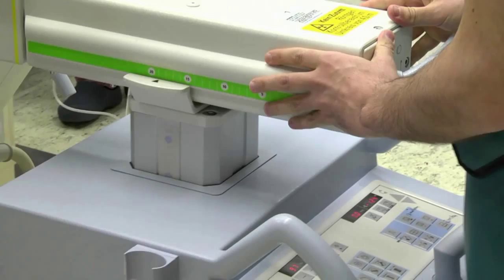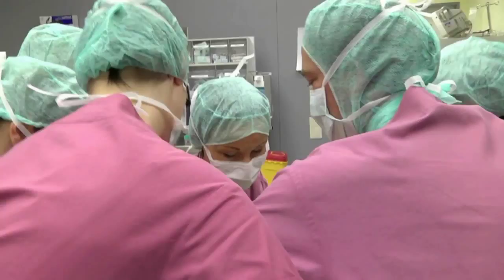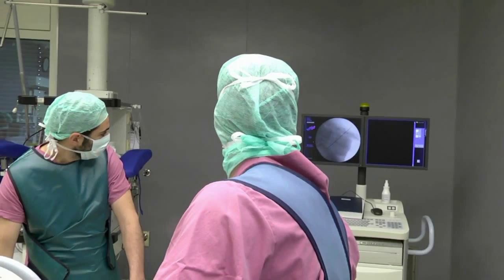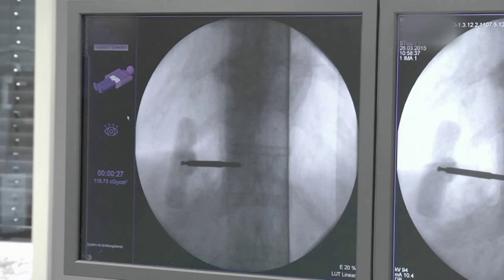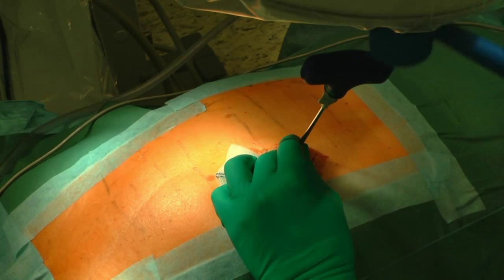By using fluoroscopy, the pedicles are visible in the orthograde position in the AP view. Jamshidi needles are placed at the pedicle entry point, then through the pedicle to the medial margin on both sides.